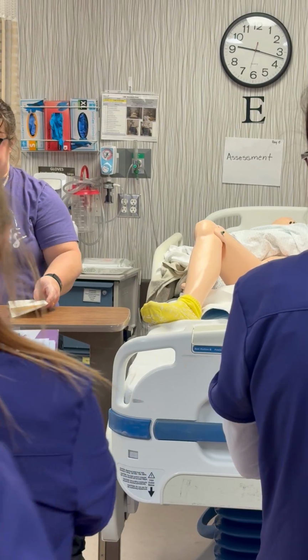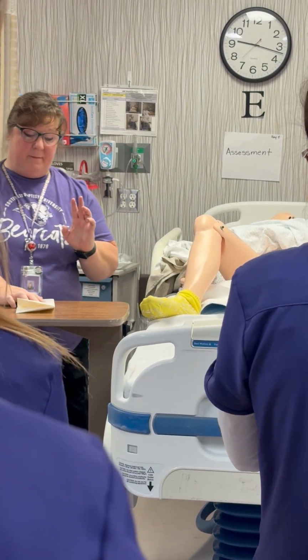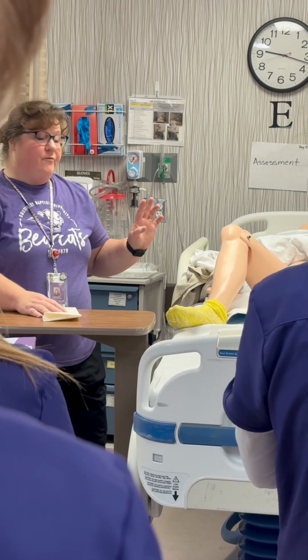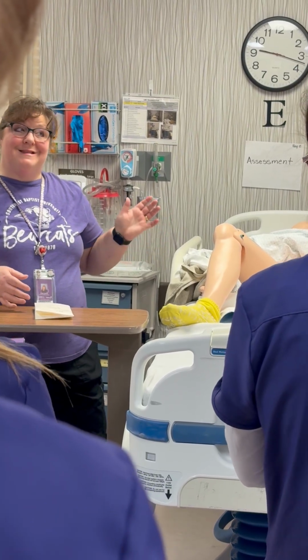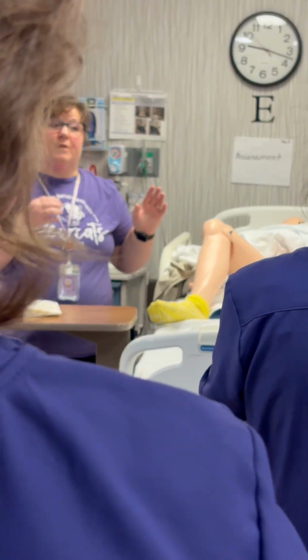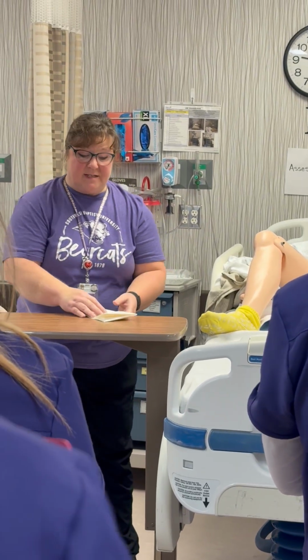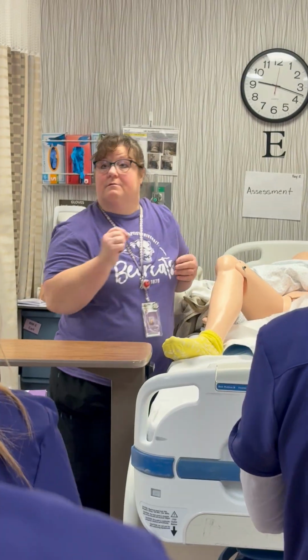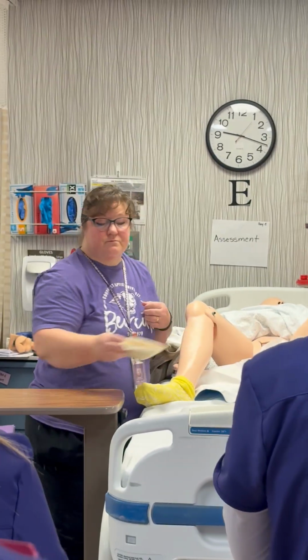When you guys do this for real, many times you've used all the Foley trays for practice, and so you'll have to refold all these trays back. You need to put them in this exact order, okay, because when you do your Foley, you're going to have time to look through that Foley, make sure everything is in there the way it should be. So at that time, you can put your sterile gloves in there, okay? Does that make sense? All right.